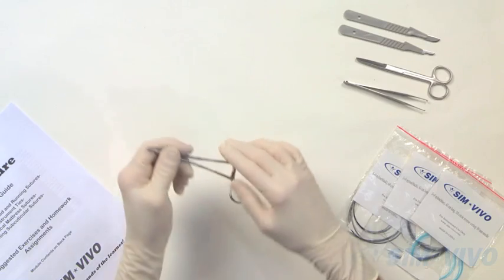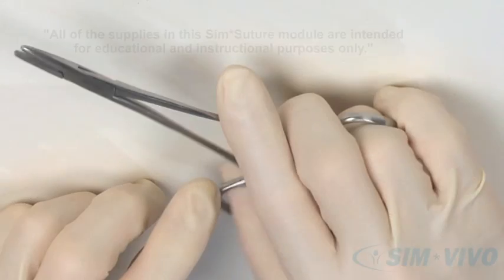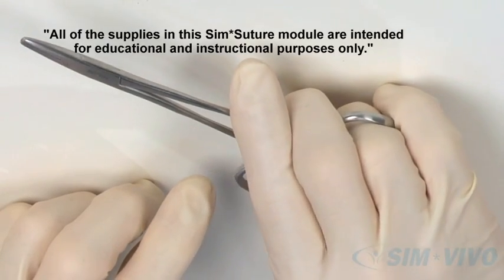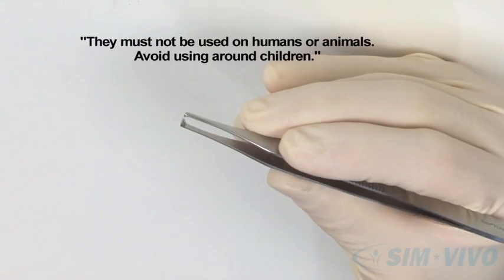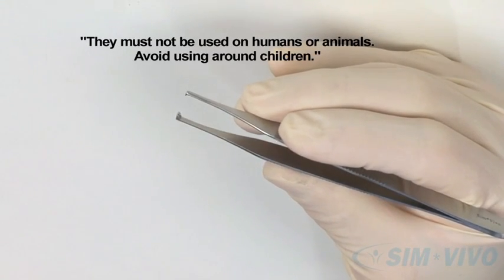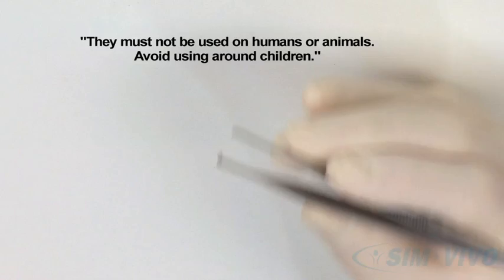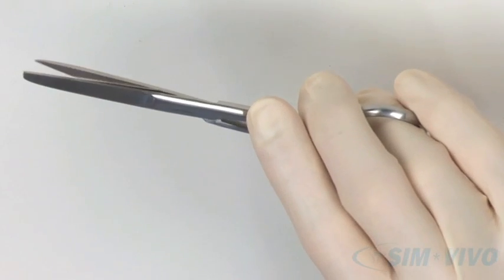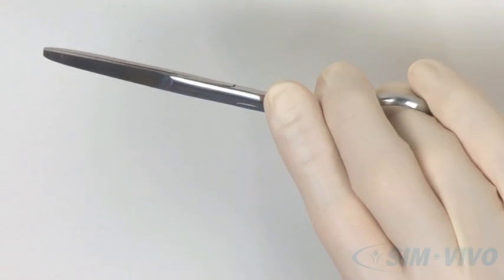This is a Hager needle holder. This is a pair of Atsin forceps. This is a pair of straight suture scissors for cutting sutures.